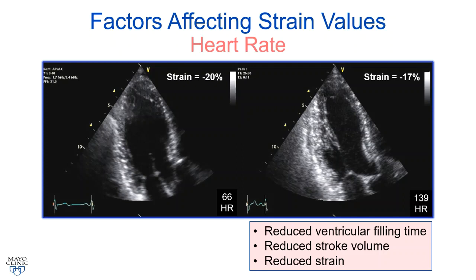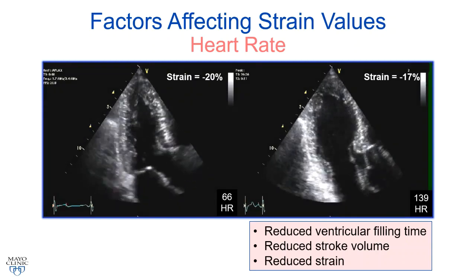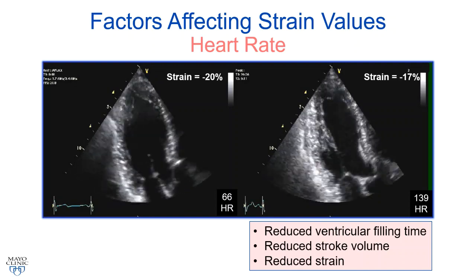Similarly, heart rate can influence strain parameters. As we increase the heart rate, you see a reduction in ventricular filling time, a reduction in stroke volume, and you can see a reduction in longitudinal strain.